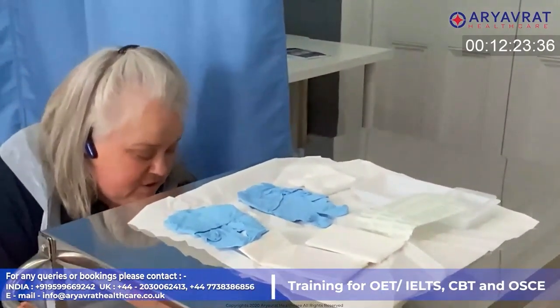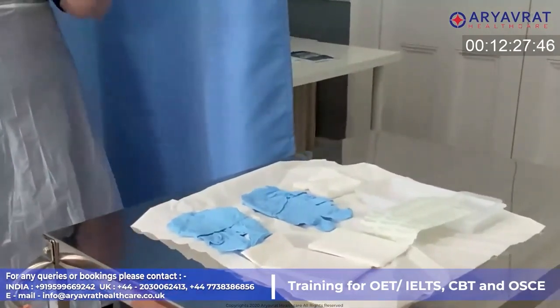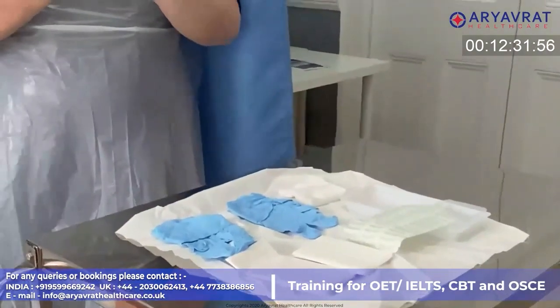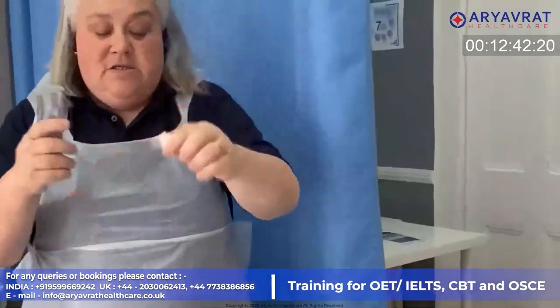I'm going to take my alcohol swab, and I'm going to clean the opening for 30 seconds and allow it to dry for 30 seconds.